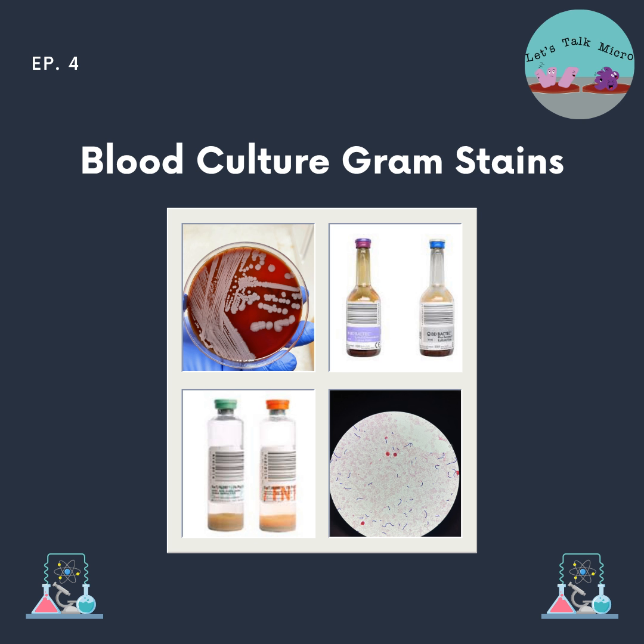And so with blood cultures, I don't know if you ever had some collected or not, but those of you that have gone to the lab, been in a hospital, and had blood drawn, they draw them in smaller tubes, right? When you go get your cholesterol checked, your A1C, it's a smaller tube. So with blood cultures, it's a larger bottle, and you typically collect two of them. You have one aerobic and one anaerobic.